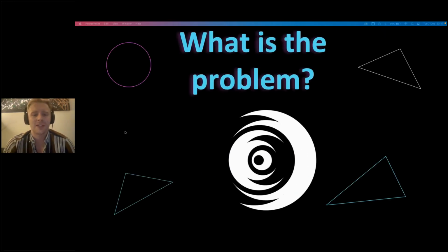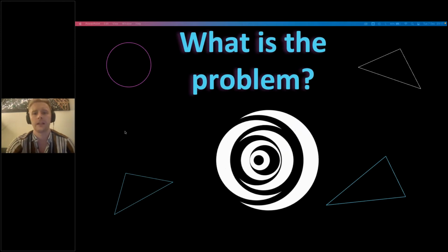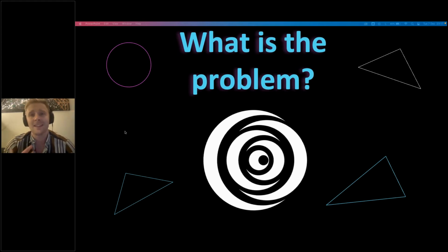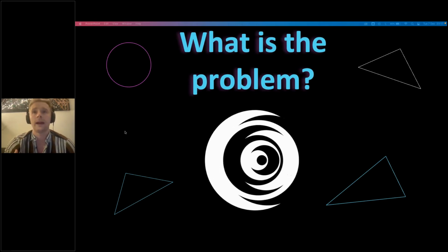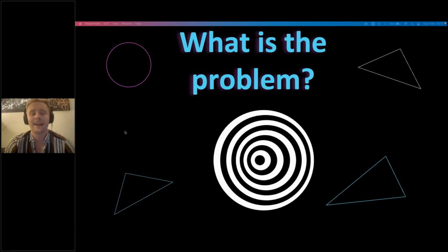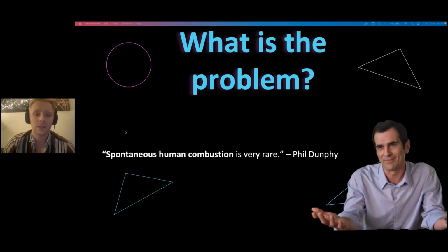So this ever-shifting target, and anyone that's refracted a keratoconic patient knows that this multifocality can cause a variable endpoint. The variable endpoint isn't just frustrating for the practitioners. It's incredibly frustrating for the patients, and quite often they do dread coming in to have a refraction done or to see an optometrist for refinement of their prescription. But we can generally improve their quality of life with a refraction, so it's the best place to start. Good news is, spontaneous human combustion is very rare, so be brave when you're refracting them. The endpoint's not always clear, but that's okay.